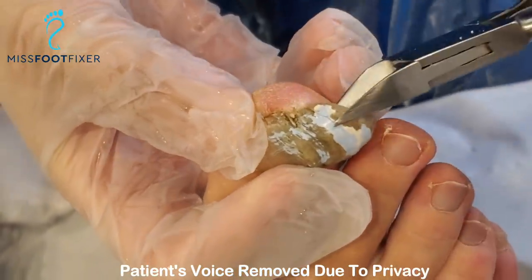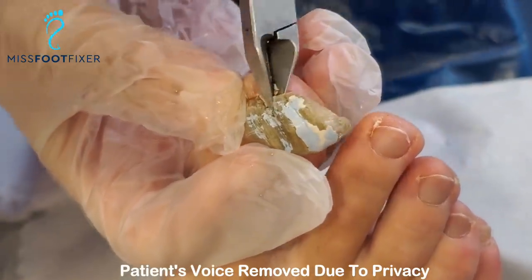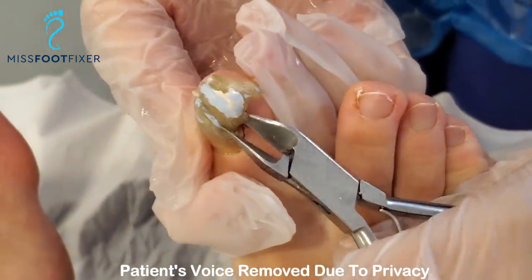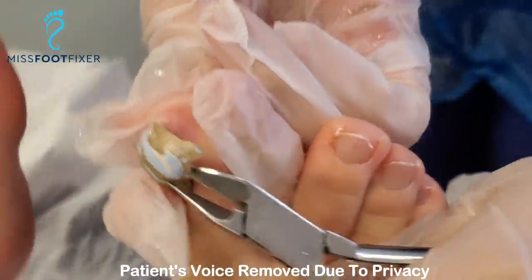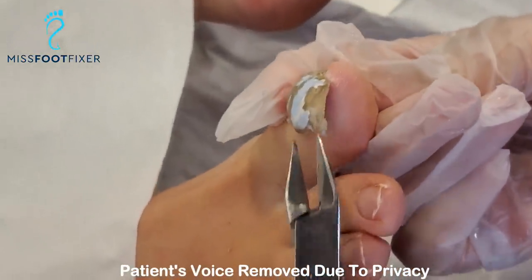Usually, if you pick one location, it comes out very, very easily. Maybe not. Let's see — over here, and it's quite lifting. Stephanie, if you come over here, look at the base of this one. It's quite in layers, isn't it?